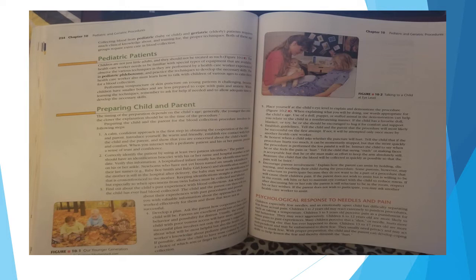Observe the various techniques as they are performed by a healthcare worker experienced in pediatric phlebotomy and practice the techniques to develop the necessary skills. The healthcare worker also must learn how to talk with children of various ages to calm them for a blood collection. Performing venipuncture or skin puncture on young patients is challenging because children have smaller bodies and are less prepared to cope with pain and anxiety.